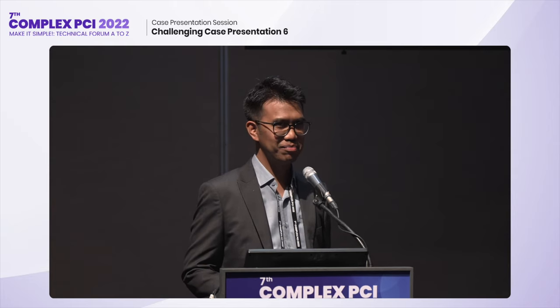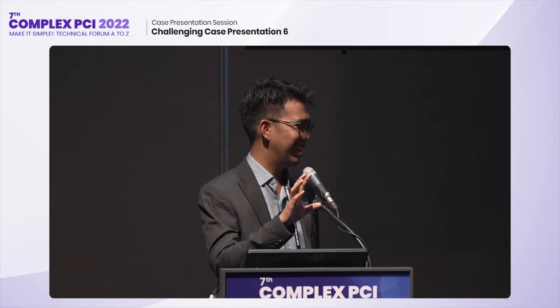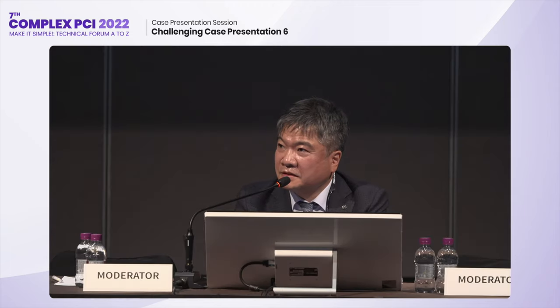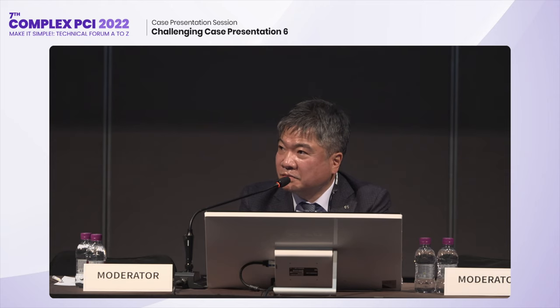Because I think from next door as well, we can learn that cosmetics may not be functional. And I think that I probably chased the cosmetics a bit too much, actually, admittedly. And there also is covered stent. Sometimes it's very difficult to get across the first covered stent. So the one thing is that when it's really difficult, maybe we can cross the first covered stent with just a drug-eluting stent. Because even though it is a drug-eluting stent, sometimes we can seal the perforated site.